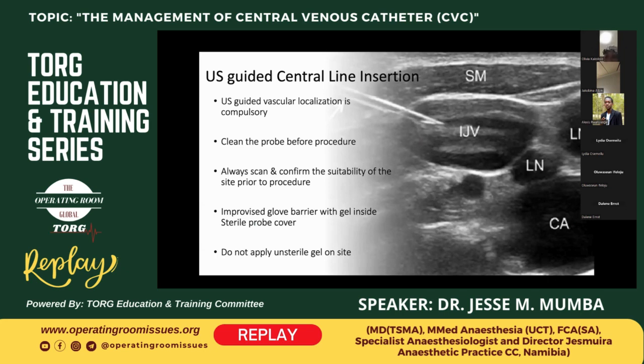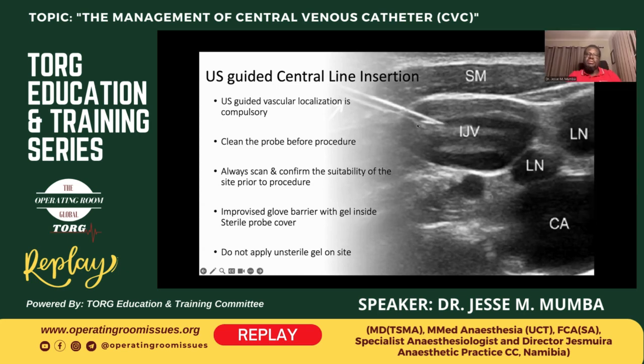If we can look at the picture in the background, you can see the needle coming in, and you can identify the structures, linking the normal anatomy and then what we refer to as the sonar anatomy. So you can clearly see that this is the internal jugular. If you had an ultrasound probe, if you press on it, it will compress, whereas the carotid artery will not compress.